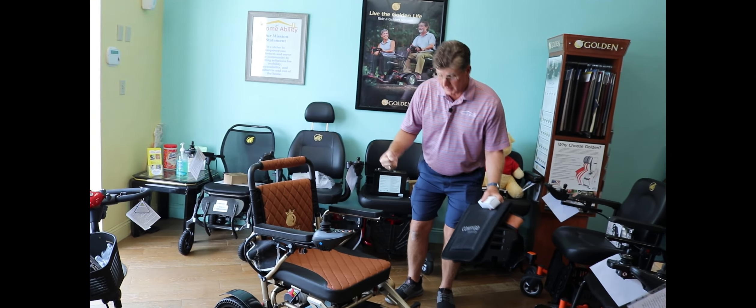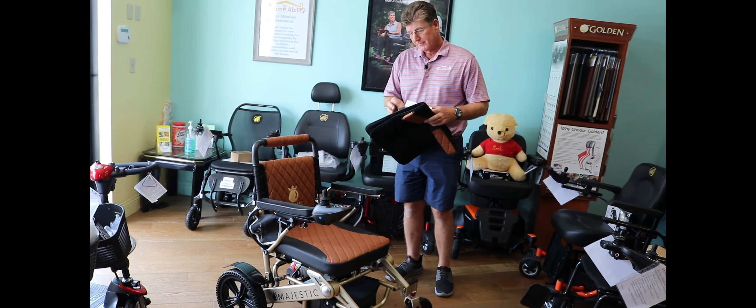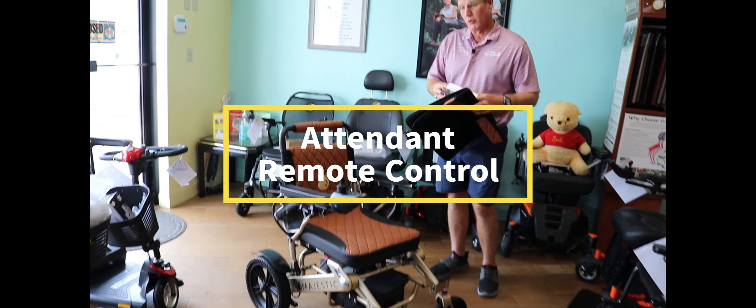That's a really cool feature — no more struggling and bending over. The other unique feature of this model is an attendant remote control.